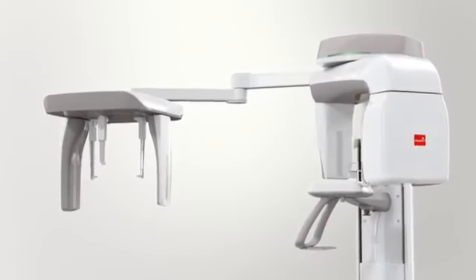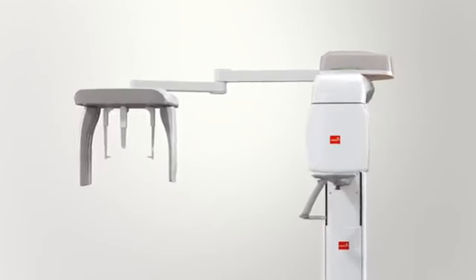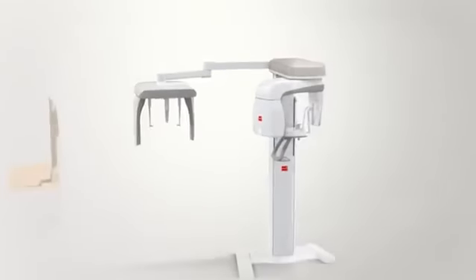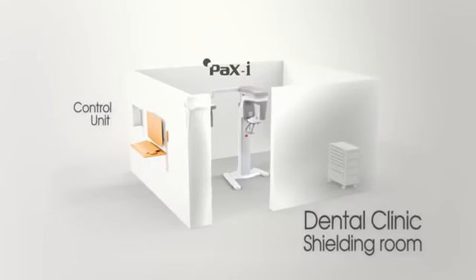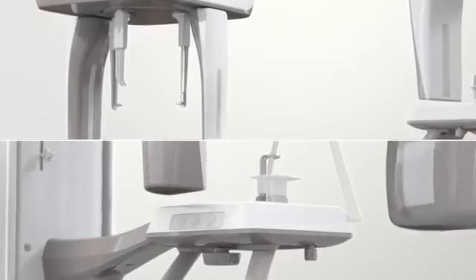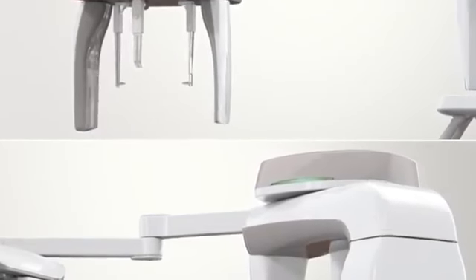Welcome to Vatech video training that shows you how to take the optimum images using the latest product manufactured by Vatech. Now you are watching the state-of-the-art medical system. Our latest system and control units will help you acquire the most accurate images.